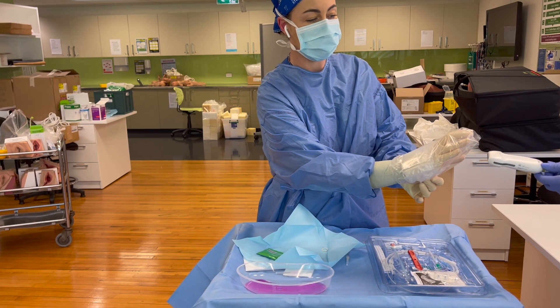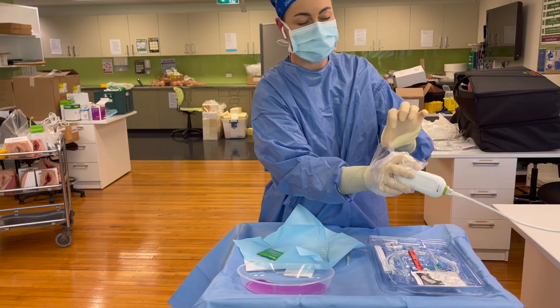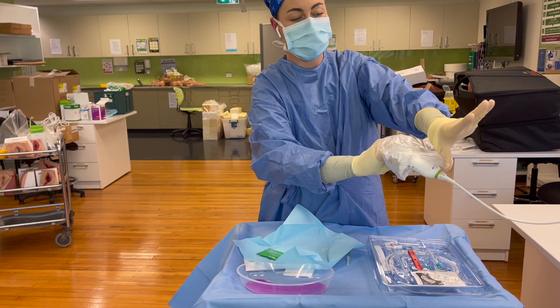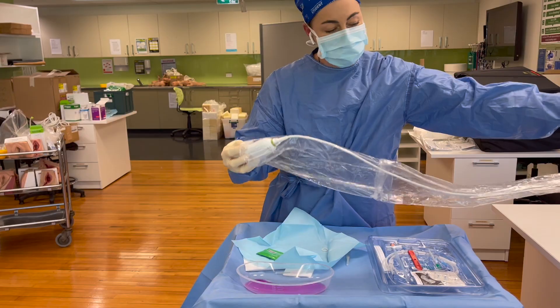Your assistant is going to place the probe into your hand, and then you will peel the plastic over the top of your ultrasound probe, being careful not to contaminate it.